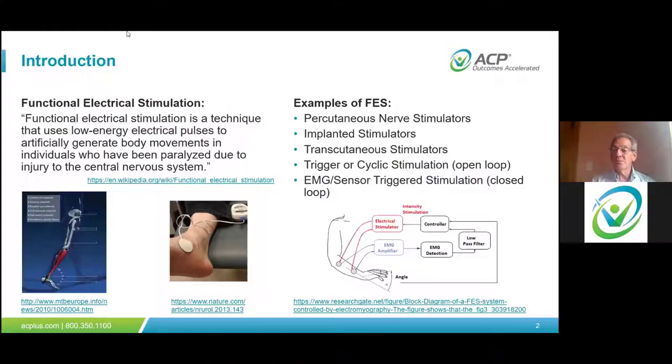So a closed loop system is a system that does have the ability to adapt to the individual needs of that movement at that time. How does it do that? It uses sensors. An example of a sensor might be a pressure switch, which is a common application for this purpose, putting, for instance, a pressure pad into the heel of a shoe, and then the pressure on and off of that pad turns the stimulation on and off according to the gait cycle. Another would be using an accelerometer in the same context, putting it in the vicinity of the joint, and changes in position of that joint would be registered by the change of position of the accelerometer, and it would deactivate and activate the stimulus appropriately.